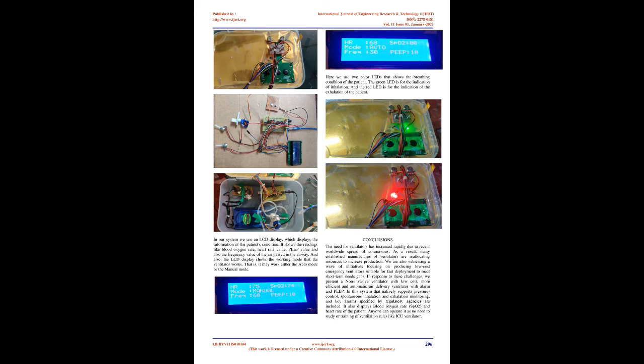Arduino Pressure Sensor Interface. Pressure sensor is an output device, which is used to measure the pressure of air in the airway. Pressure sensor is connected to the SCL and SDA of Arduino to the SCL and SDA of pressure sensor, and also provide the ground and VCC.